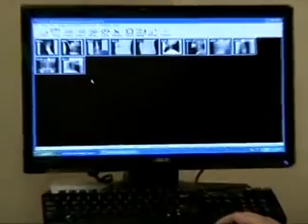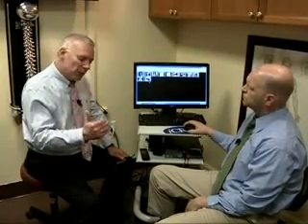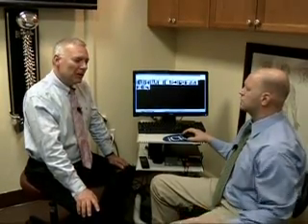I had a case the other week where somebody had sustained a hockey injury, and they injured their tibia. When I did the image, we had suspected a fracture, and there was no displacement of the tibia or the leg bone. But when we actually went inside of the bone with the machine, we saw a fracture line that was not displaced, and we would have never picked that up on a plain plate film before. And the interesting thing was that before this device, we would play it safe and say, okay, you can't play hockey for 3 weeks. We're going to stabilize that, put that in a boot just to make sure.